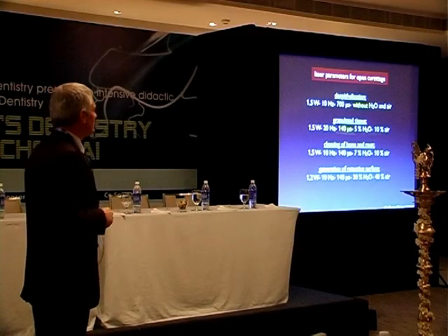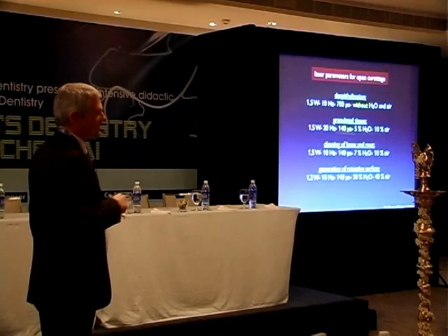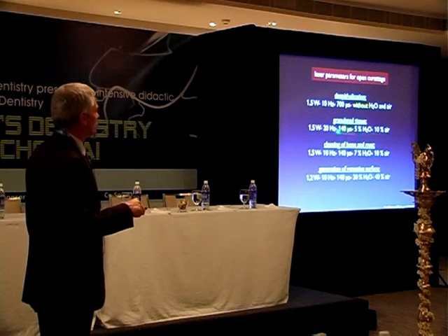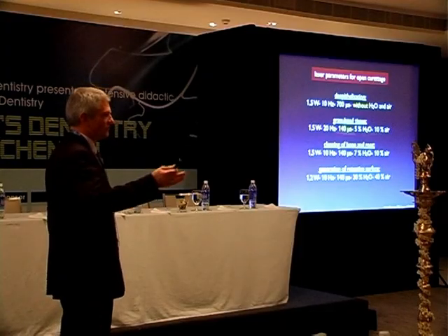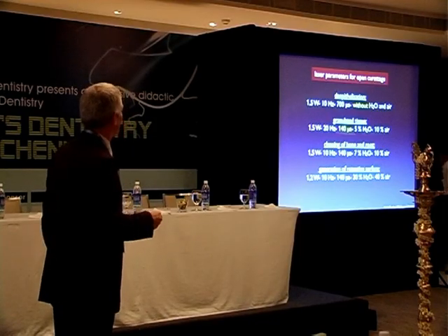The laser parameters for erbium lasers in open curettage are, for de-epithelialization, long pulse, because it's soft tissue without water and air. The granulated tissue you can remove with a short pulse, because it doesn't matter if you harm it. You just want to get rid of it. So with a short pulse, it's getting a little bit faster.